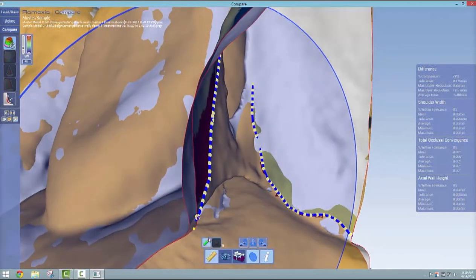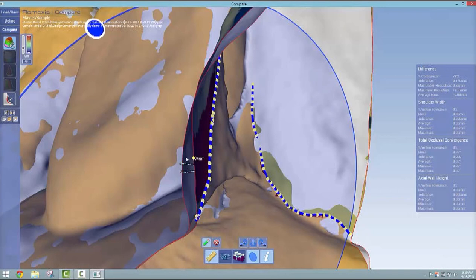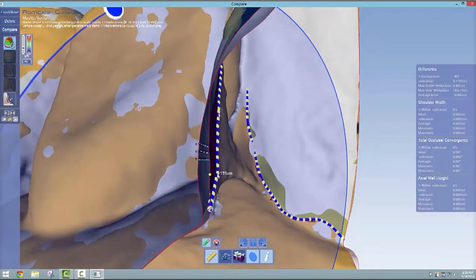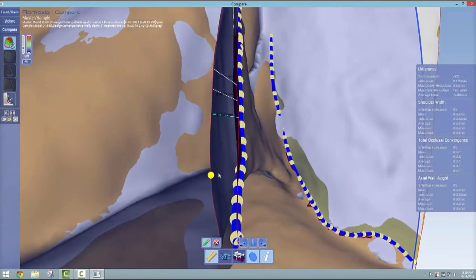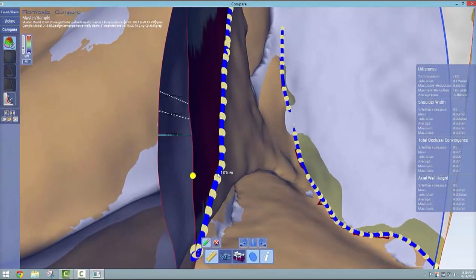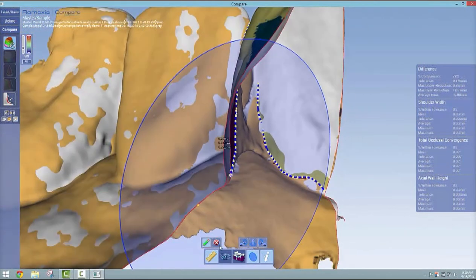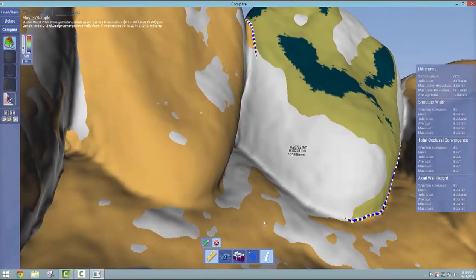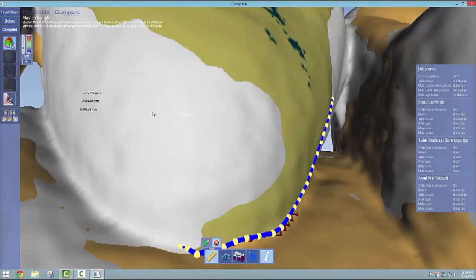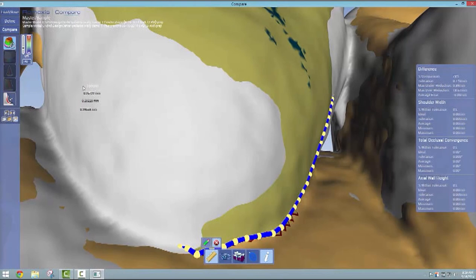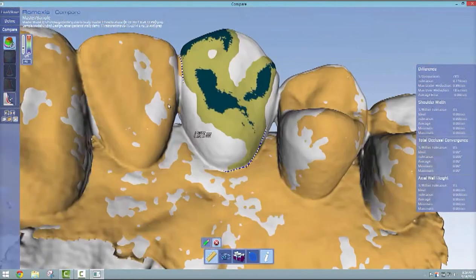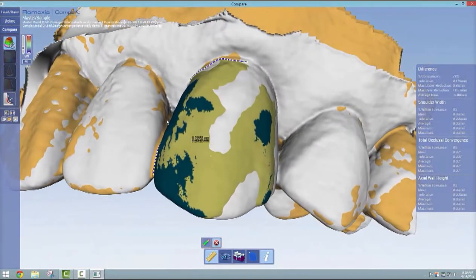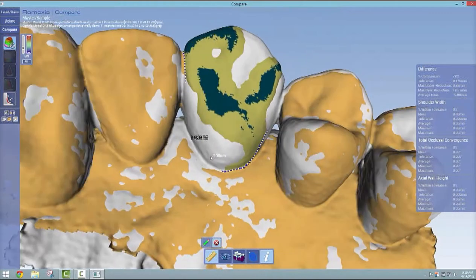Notice that the faculty master or preparation or wax-up, whatever is the master, is white or gray color and the student's is always that stone gold color. Here we're slicing over this area. You hit the pencil on the measurement tool and click between the two lines and it's going to throw out some numbers where you're off. But you really don't need to do that slicing, it's sometimes cool to see, but you can just ghost your mouse over anywhere and it's automatically going to update with a micron number. It's just going to change wherever you scroll your mouse over. That's kind of doing the slice without having to slice. In addition, you have the color map there.